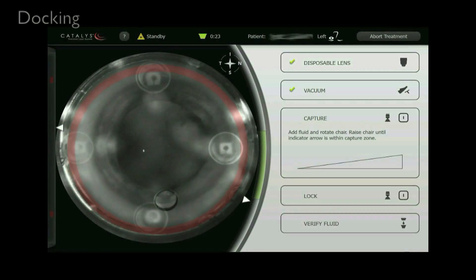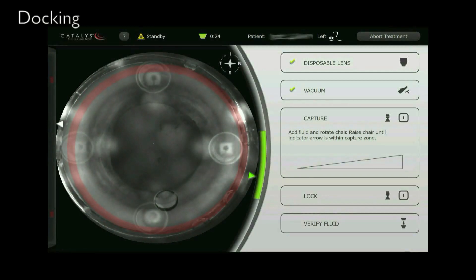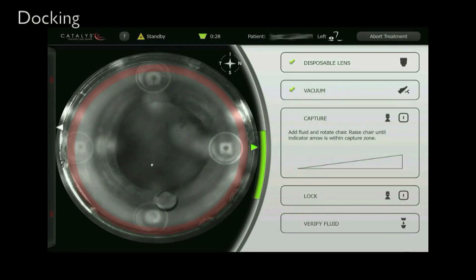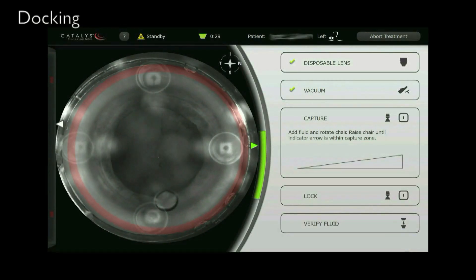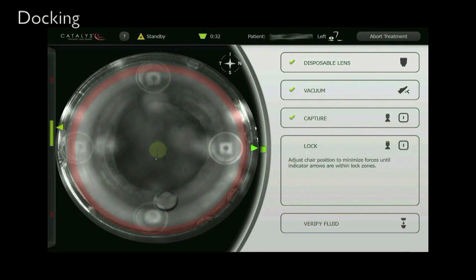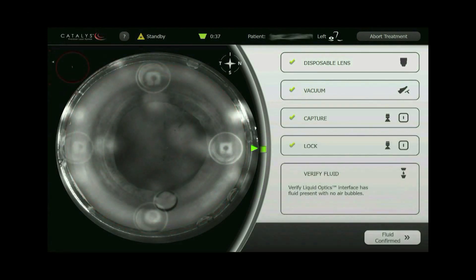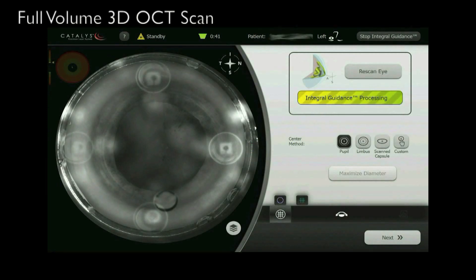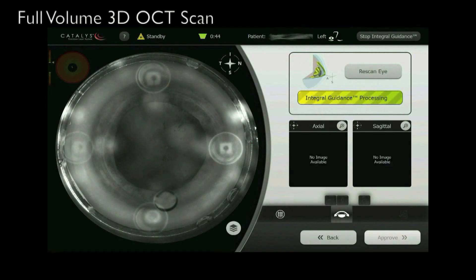First we dock the liquid optics interface of the Catalyst Precision Laser System. The indicators on the screen guide us through the process. Integral guidance starts automatically with a full-volume 3D OCT and the anatomical structures are identified.